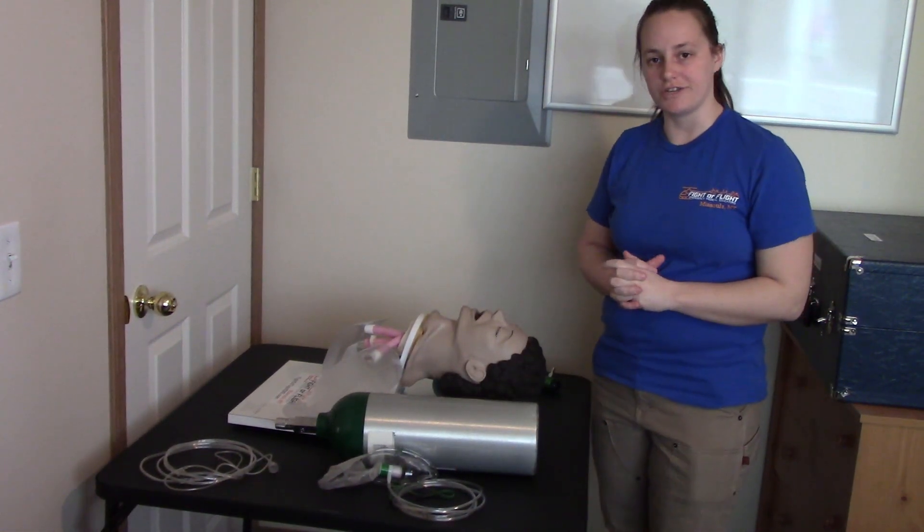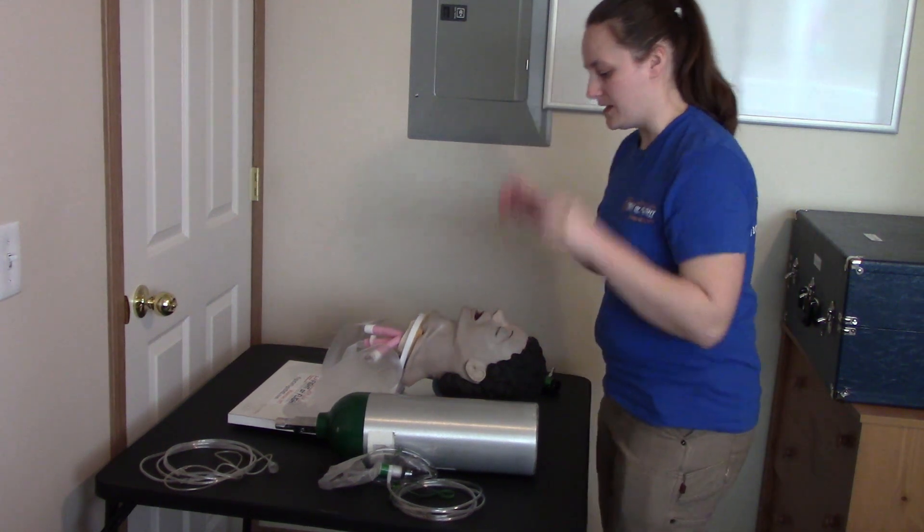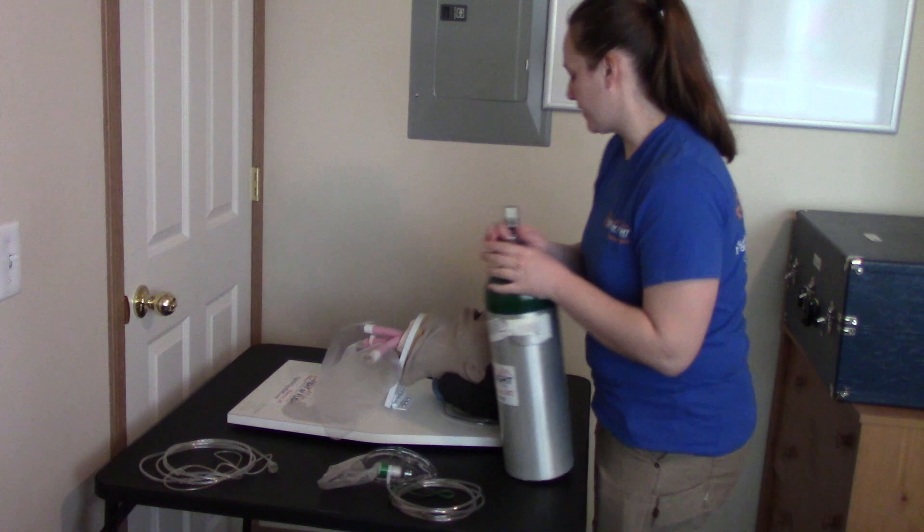This is a demonstration of the oxygen station for the National Registry practical skills exam. I'm going to apply PPE and then apply the regulator to the tank.